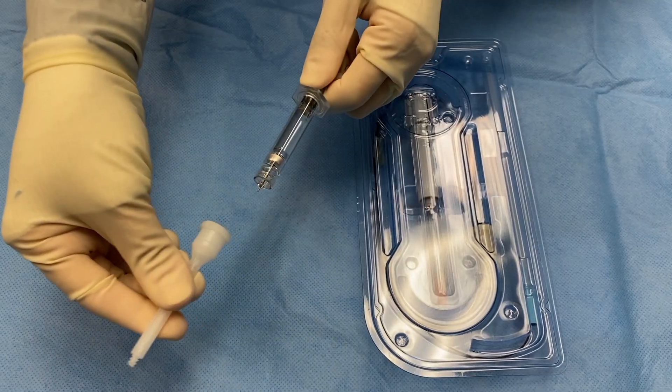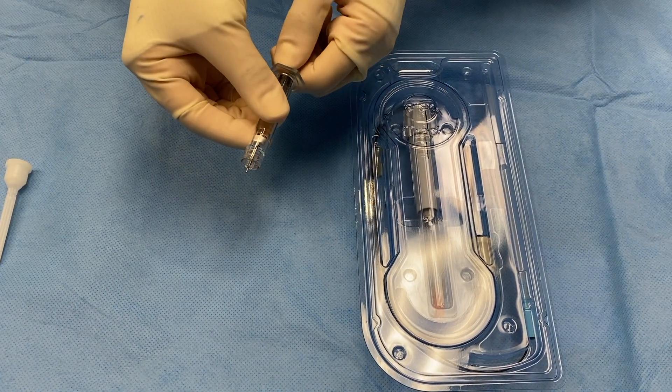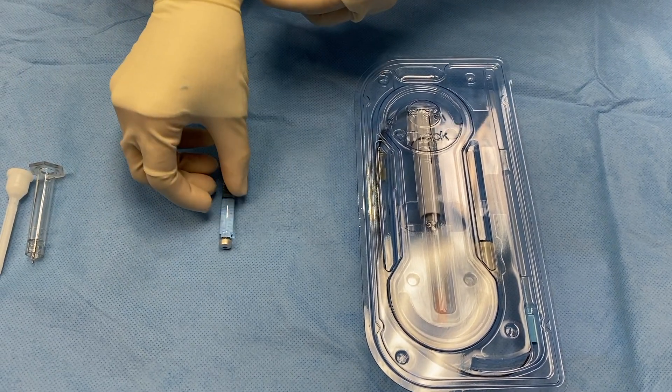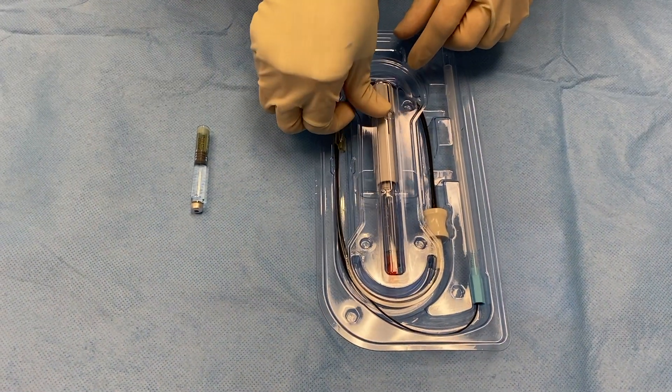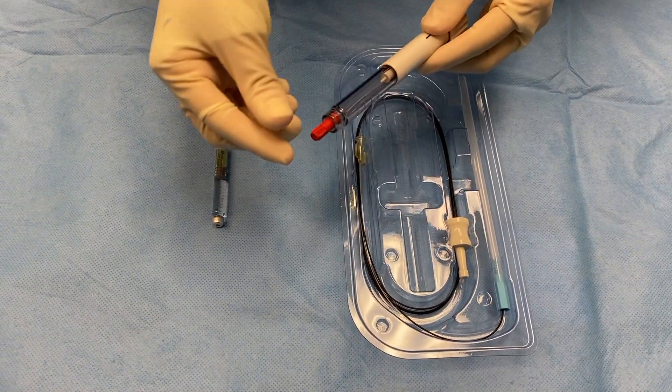Remove the eye-track tray and viscoelastic from their packaging and place on the sterile field. Separate and discard the original viscoelastic syringe from the ampoule. Remove the tray lid and the viscoinjector cover. Remove the red cap and unscrew the viscoinjector body.